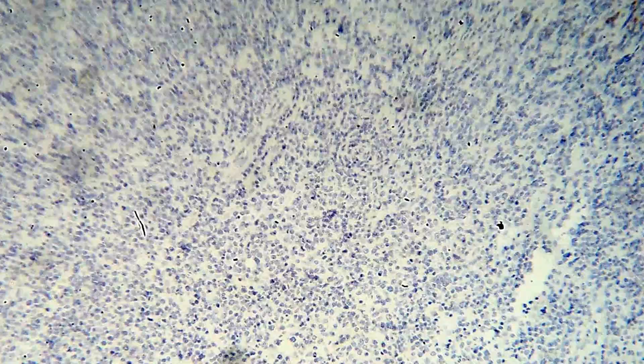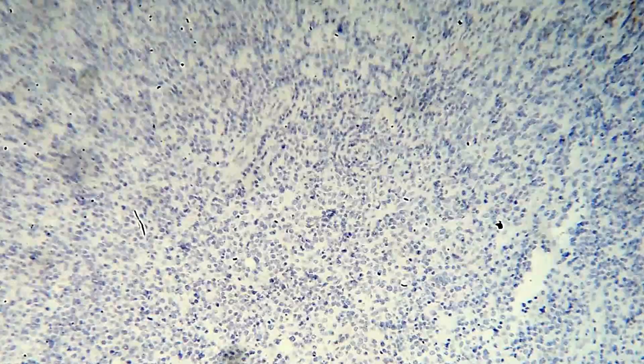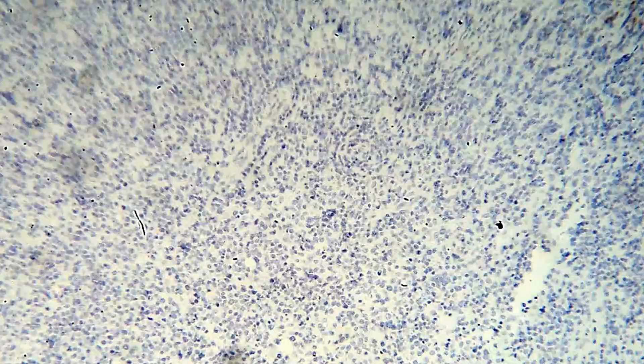Since we also did CD20 staining, we know these tumor cells are B cells. They don't have CD3 receptors in their membrane, which is why they're CD3 negative and CD20 positive.